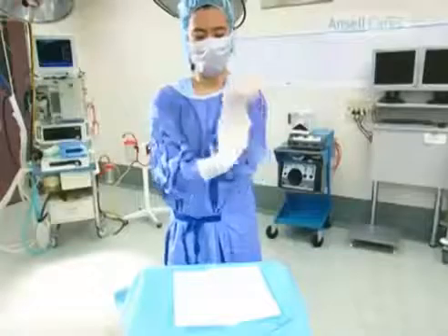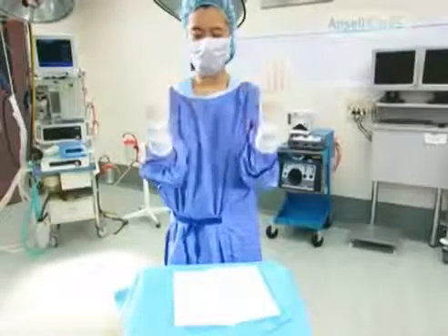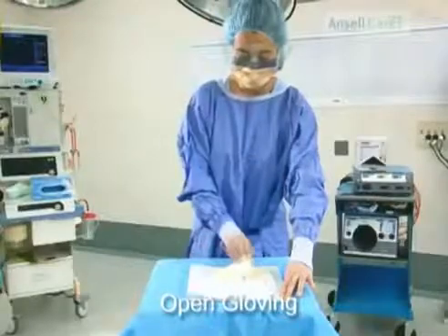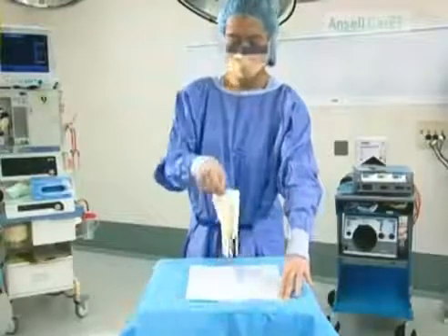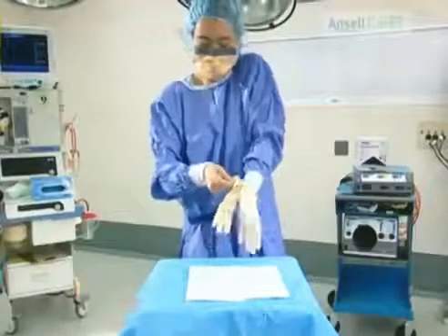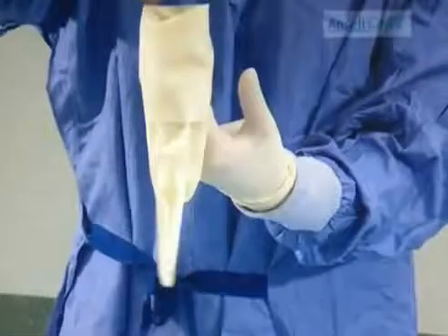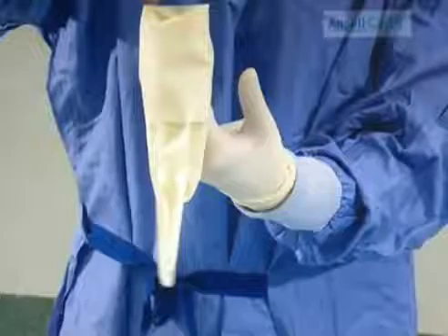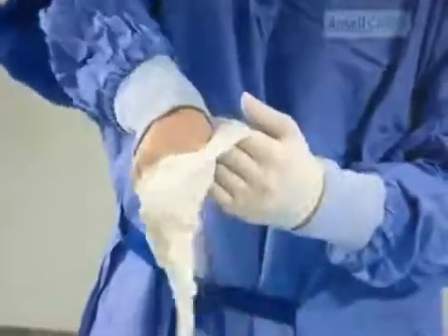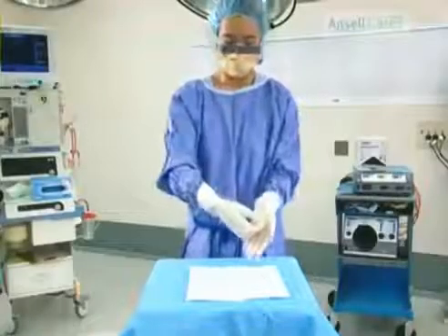Once gloves are fitted, gently pull the gown sleeves down to remove any uncomfortable folds. Hands are exposed. Hold the two gloves together cuff to cuff. Slip the left hand in, then slip the gloved fingers under the right cuff, keeping the thumb outstretched to avoid touching the right hand as it's inserted into the glove. Pull the cuffs up and over the gown cuff.